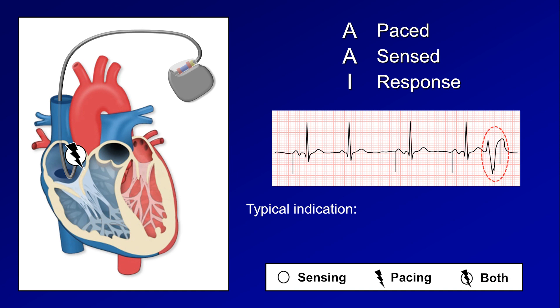That pacing spike on the T wave — is that risking V-fib? In this case, no, since that pacing spike is not being delivered to the ventricle but rather to the atria, which we can only tell for certain because we know what mode the pacemaker is in.